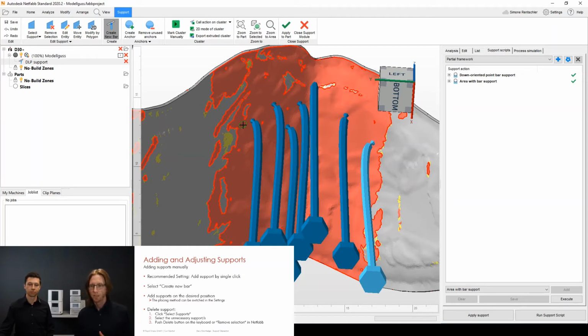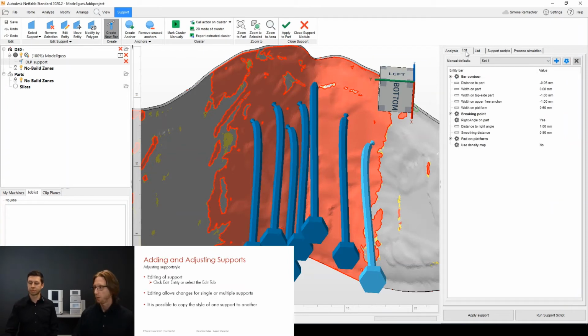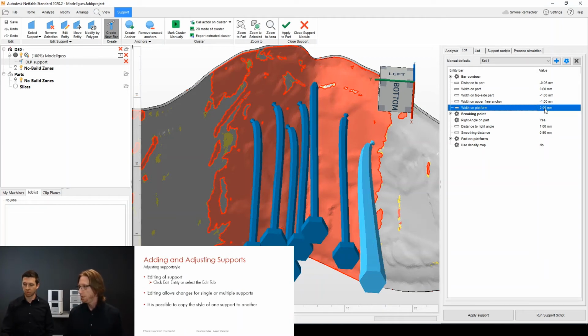So now let me talk a little bit about editing supports. So let's see what we can do here. Let's say we just want to perform a change on a single support. What you do is you just go to the Edit tab on top here. And what you do here, just for the purpose of the webinar, I would say we make a drastic change here. So let's say we have a very big width on the platform. So this is 2 millimeters, so you can immediately see what's going on.